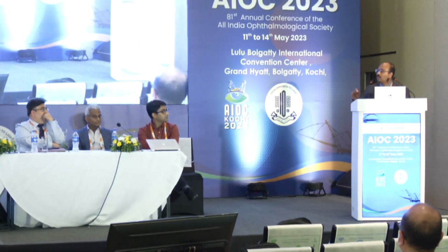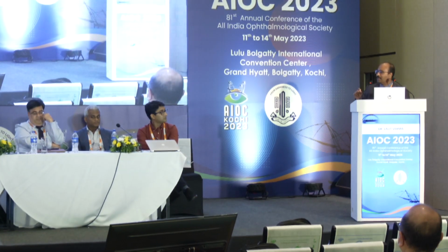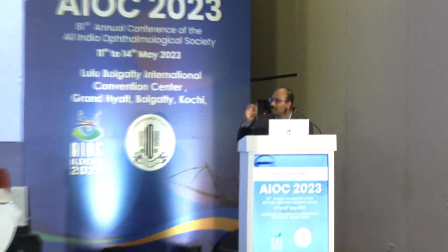Yes, I agree, because just harking back to the point which Dr. Aminda and Ritesh made, sometimes networks may not show. It's all flow dependent. It's virtual. The OCTA network is actually virtual. So if the flow is very slow, you might just miss a network. Also, if the slabbing is not perfect because the RPE is highly corrugated, then you may miss it also. So these are issues where FFA will score.